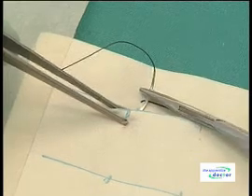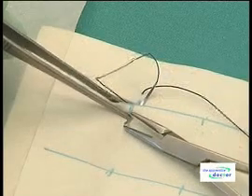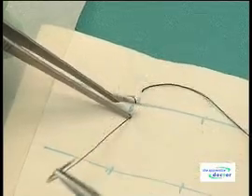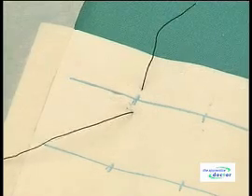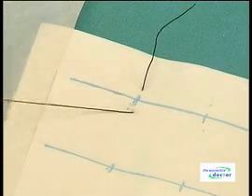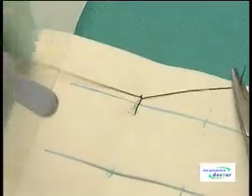Try to mirror the course of the needle on the two sides. Deliver the needle completely out of the tissue, including most of the suture thread, but leave a section of thread free. Tie an instrument square knot and cut the loose ends.